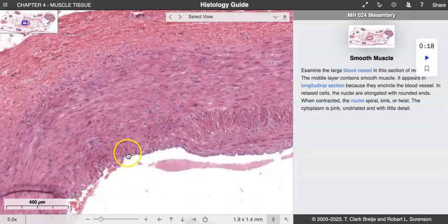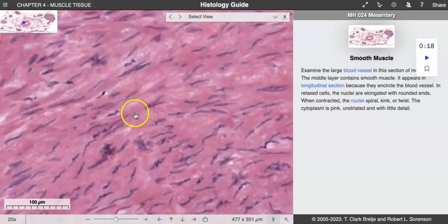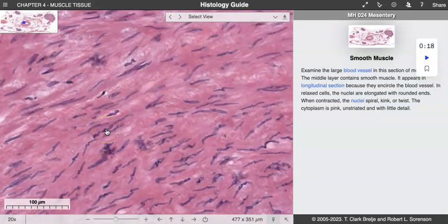So the endothelial layer is here, and then lots of smooth muscle, and don't confuse that with the dense irregular connective tissue outer layer. And you hopefully won't, because they stain differently. There's a different color to them, and also a different texture. There are a lot of nuclei in both, so that might throw you off, and you're like, oh, is it the same? And note that no, it is not. And if we go in with closer magnification, again, you might see some elastic fiber stained in here because there's a lot of connective tissue in our vessel wall. But these are all of those nuclei for each individual smooth muscle cell.